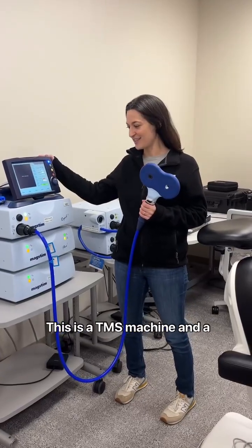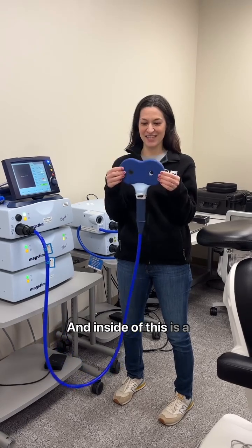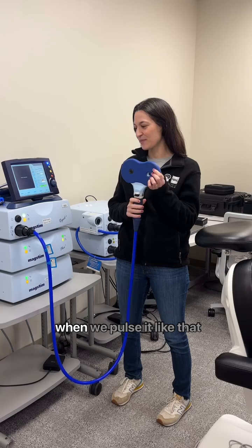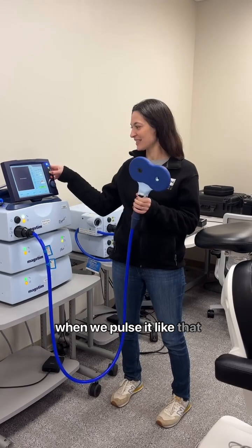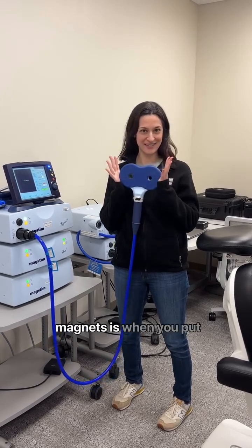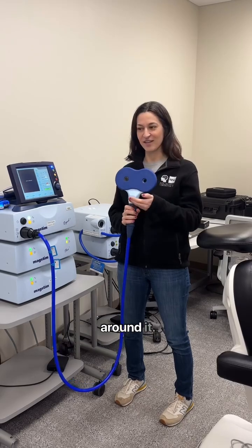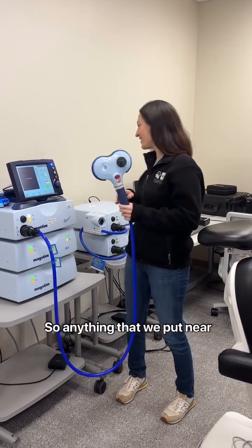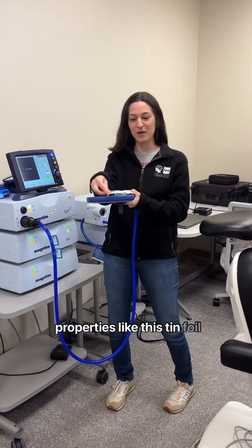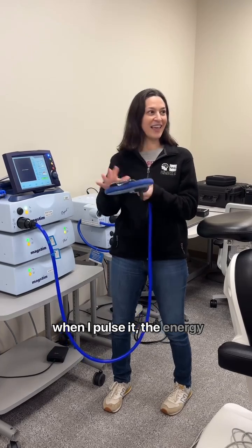This is a TMS machine. It uses a coil with a magnet inside. When we pulse it, it pushes electricity through the magnet. The cool thing about magnets is that when you put electricity through them, it creates a magnetic field. So anything we put near it that has electrical properties — like this tin foil — when I pulse it, the energy goes into the metal.